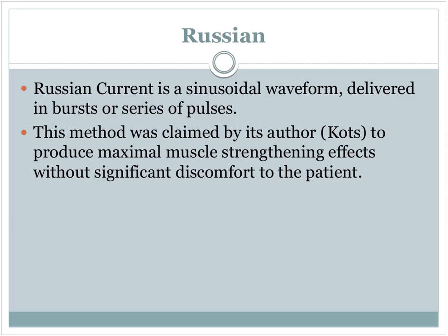It's very smooth, up and down kind of look to it. It can be delivered in bursts or a series of pulses, and it's claimed by the author that it'll produce maximal muscle strengthening effects without significant discomfort for the patient. So there are different waveforms that you can use to create muscle contraction. The claim is that this one is more comfortable.